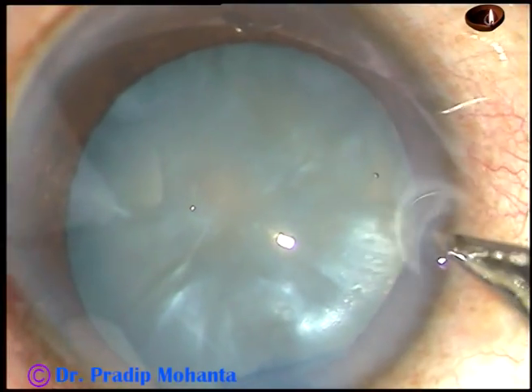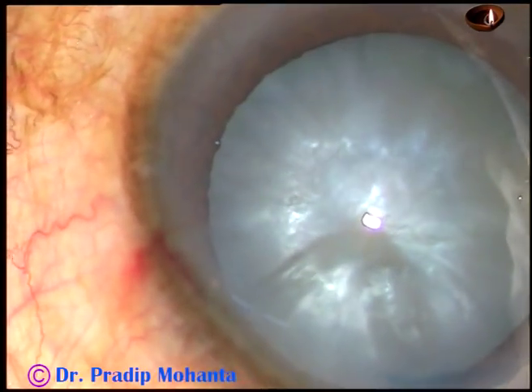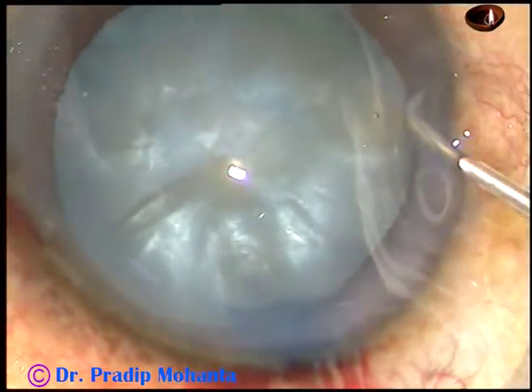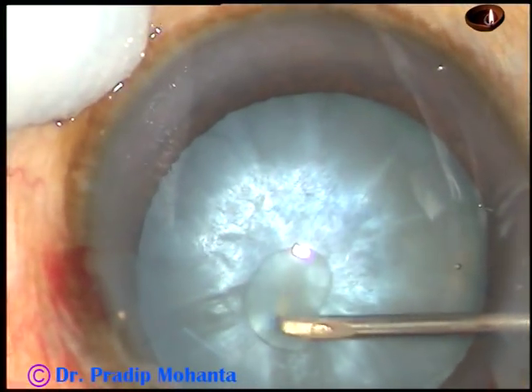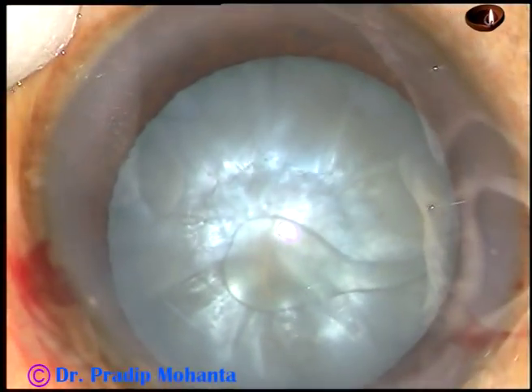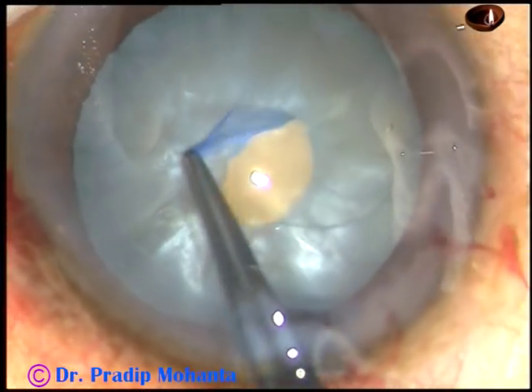This is another sideport on the right side of the main incision. I usually make two sideports in intumescent cataracts and make the initial nick from the right sideport. Make a C-flap, a little curved flap. See, some oily fluid has come out — it indicates that there is high intralenticular pressure.